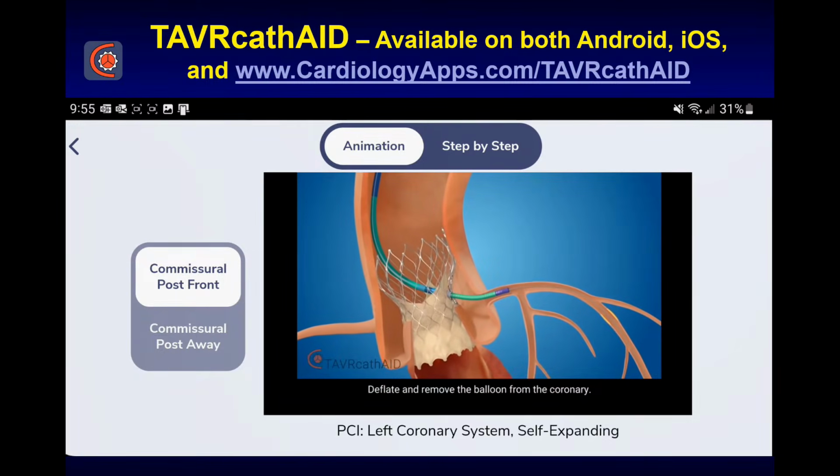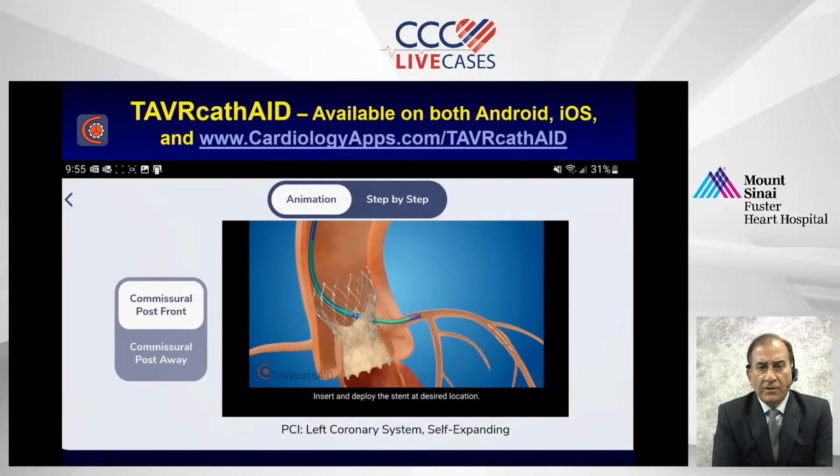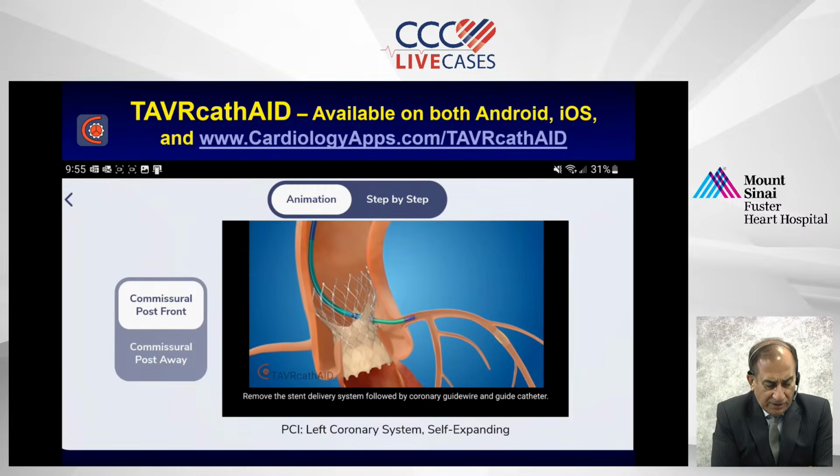Yeah. Dr. Nikhil Jha had actually inquired about guide extension catheter. So Nikhil, there you have a wonderful demonstration. But Samin, he's asked a very interesting question. How do you confirm if the Evolut got deformed or not? No, it's very clear on the cine now. Yeah. You can show it.